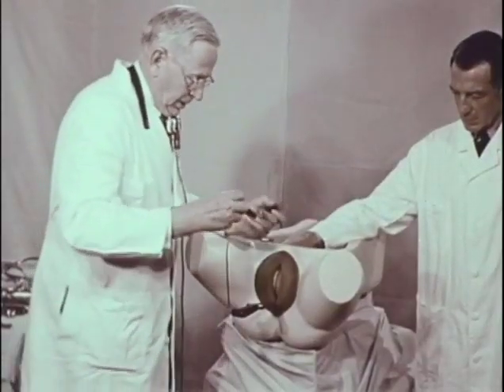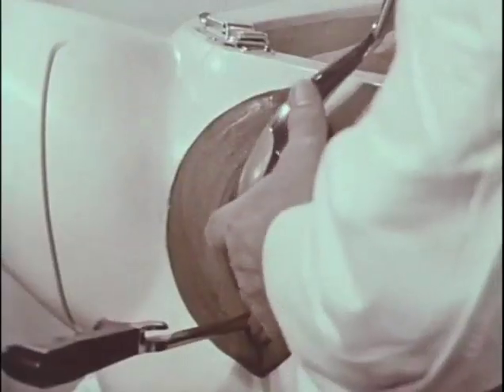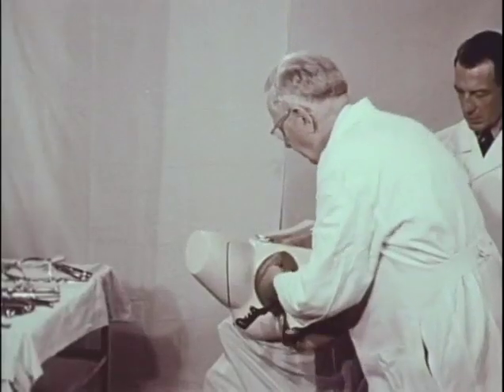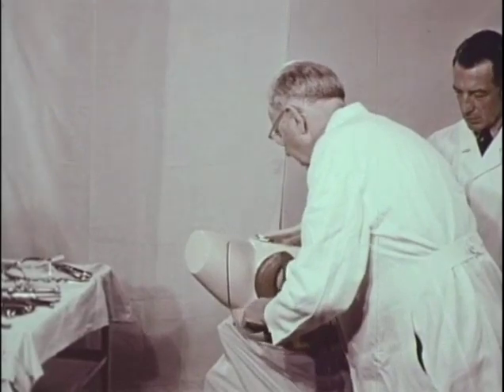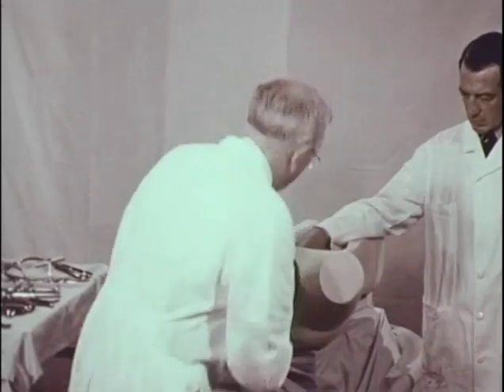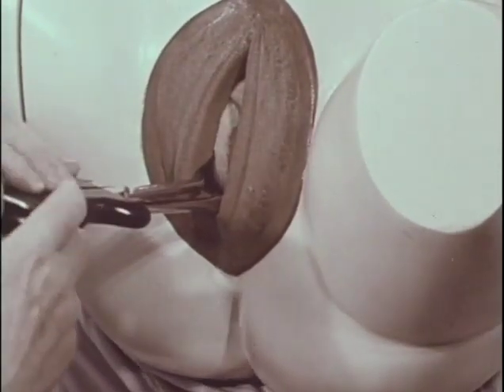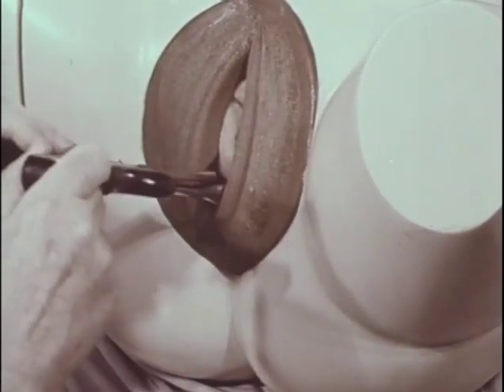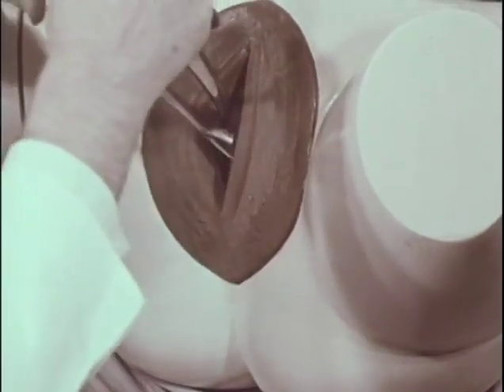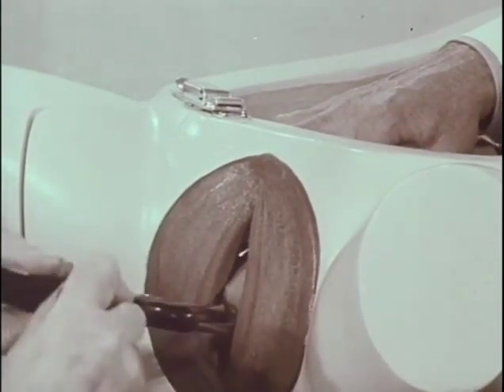Reinverted, the right blade, held in the right hand, inserted to the right side, opposite the baby's right ear. Check our application. We have some extension, signified by the anterior fontanelle being 2 fingers breadth above the plane of the shanks. Unlock and elevate one at a time, each handle within 2 fingers' breadth of the perineum.